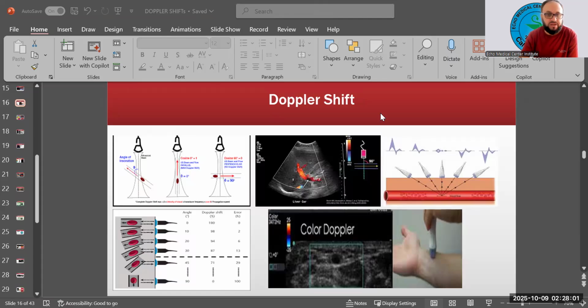This is still the continuation of what we had earlier. So, Doppler shift. Remember, guys, we just said your best angle for the color Doppler has to be zero angulation. You see the pulses are coming straight down, and the flow or RBC is going straight towards the pulse. That is the best Doppler angulation because you will not miss even a single RBC. Even a very tiny, small flow will be visible because all pulses will interact with it and give you the information. In that case, it will be a positive Doppler shift.